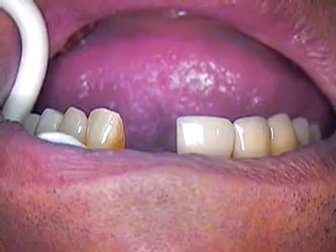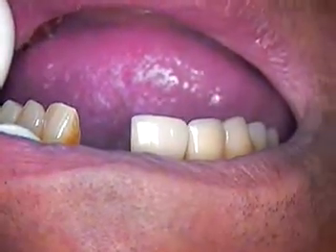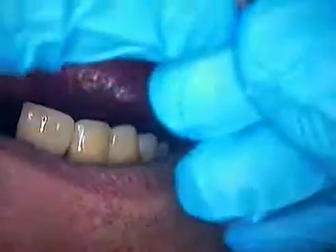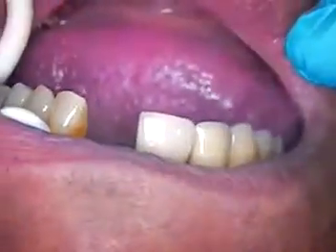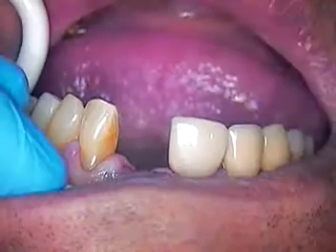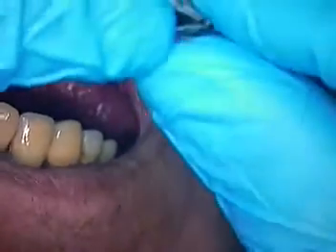This happens to be a Core Vent case that we've talked about earlier. We have a crown off with a broken screw that was presented. The half of the screw is fractured and it's within the implant fixture. This is a Core Vent, now called Zimmer, because Zimmer owns the company.